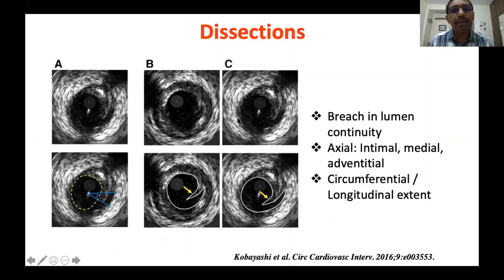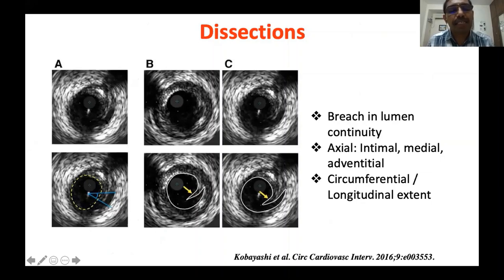What is dissection? Dissection is a breach in lumen continuity. Here you can see lumen continuity with a breach in it — the typical appearance of dissection. Dissection is classified by axial extent: intimal dissection, medial dissection, or adventitial dissection.